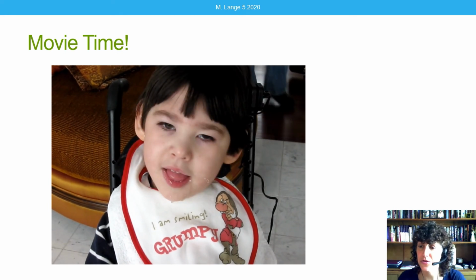Well, I guess that switch was actually red. It's just hiding under that gorgeous hair of his. But he is also listening to his choices. He has visual impairment as well and is doing very, very well.